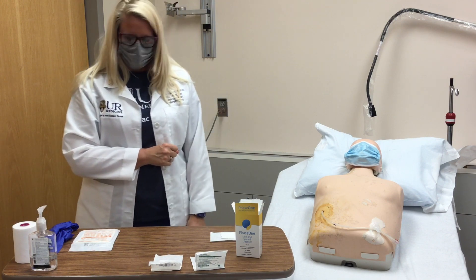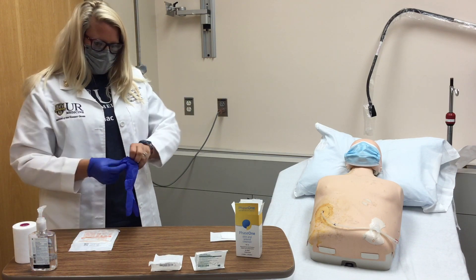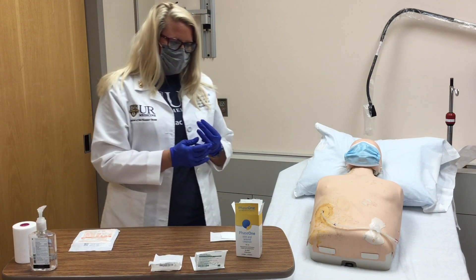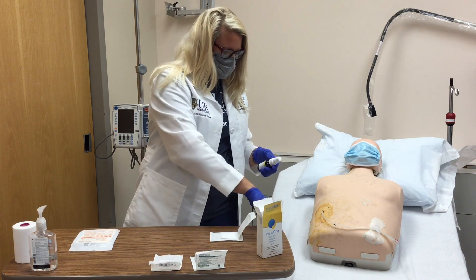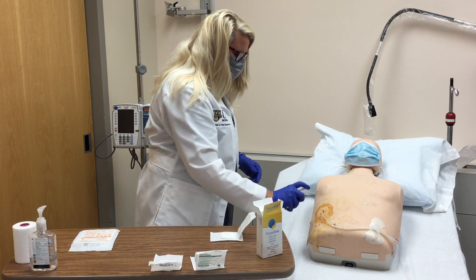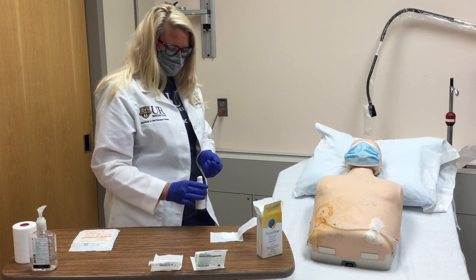Now place your pair of clean gloves on. We're going to spray the driveline exit site with the Phase One product and allow it to soak for a recommended 60 seconds. Next step is to spray the additional gauze until it's wet, not soaked.